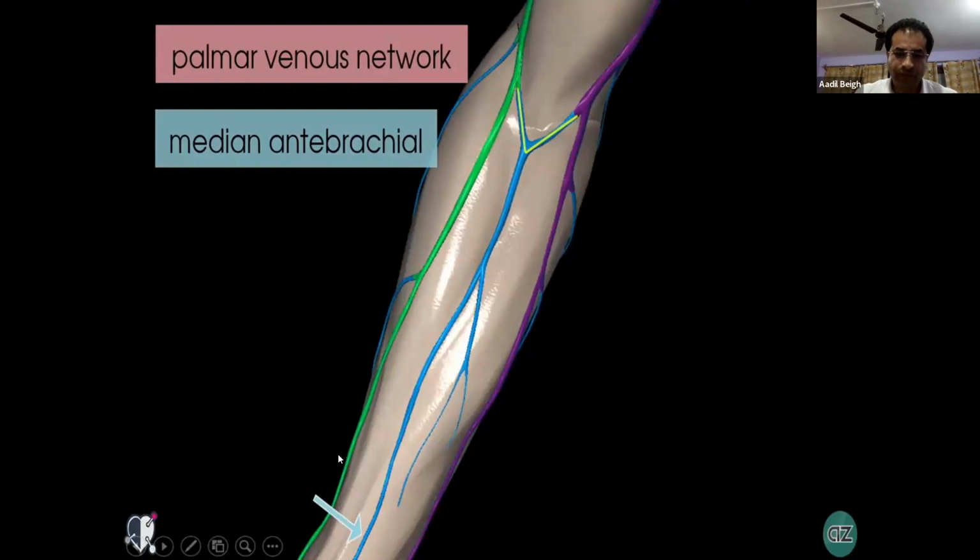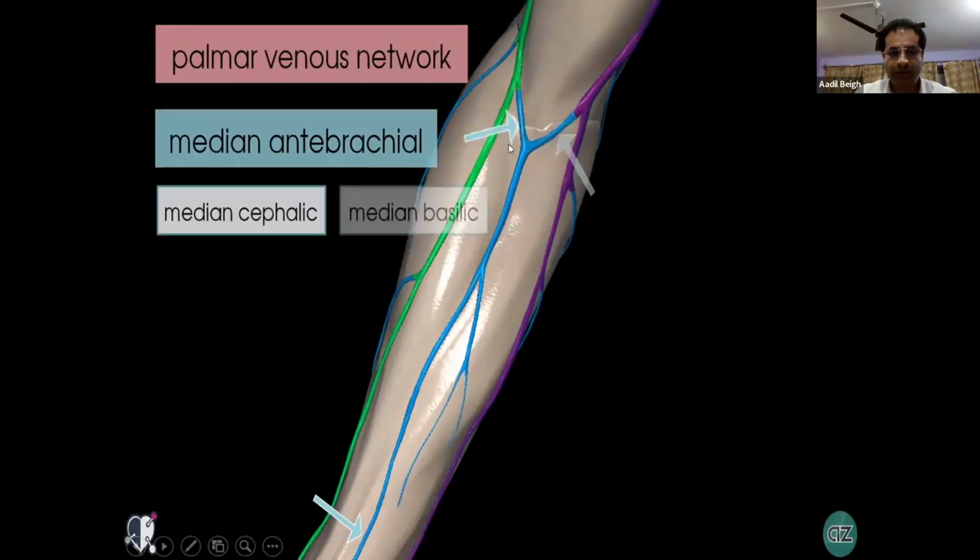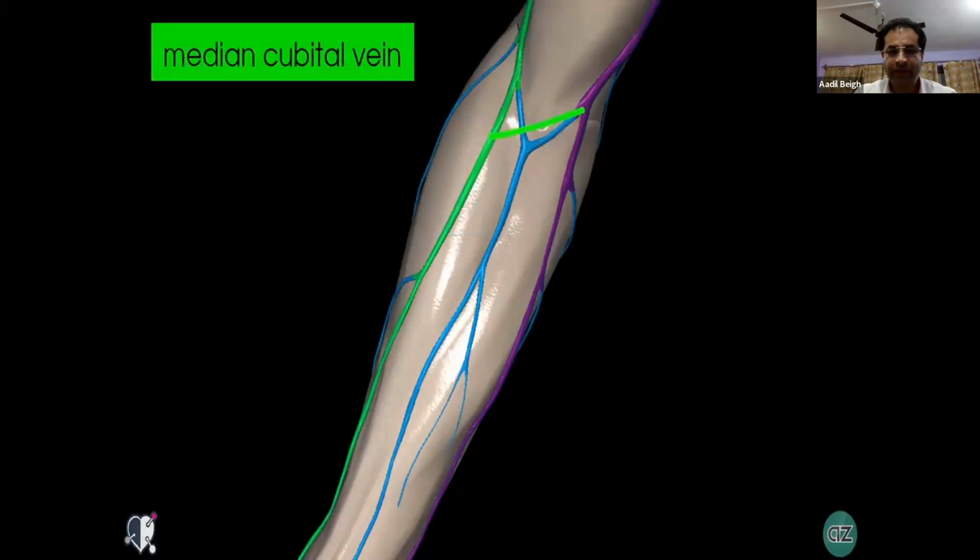So when we go for the ultrasonography of this portion, we have to see the outflow. For example, we have to make the radiocephalic fistula. So we have to see the outflow of the cephalic vein. Is it the cephalic vein of the arm, or is it the basilic vein of the arm? Whether the blood will be taken by the basilic vein predominantly, or the cephalic vein, or both. So there will be variation. There are some variations where the cephalic vein directly joins the basilic vein, or it may continue as a cephalic vein of the arm.